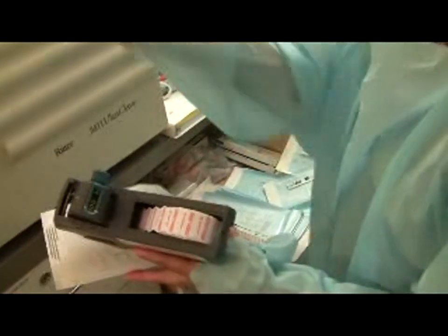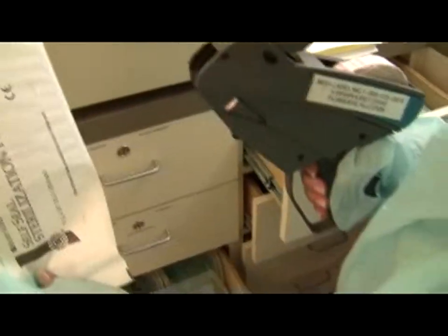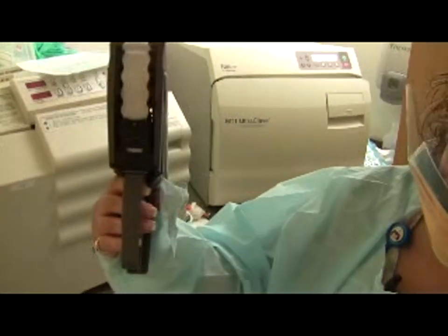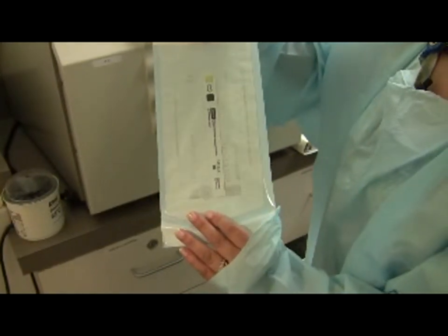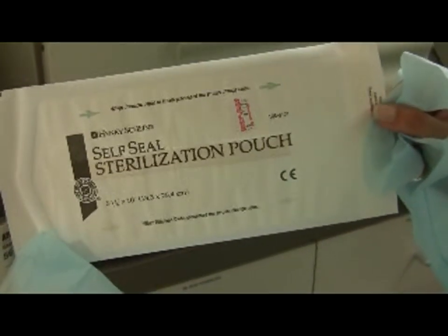Put the date sticker on each pouch — squeeze the sticker gun handle to release a sticker, then roll it across to apply. Each pouch must also have an indicator strip. The unused strip is black with a yellow box; when proper sterilization has occurred, the yellow box turns black. Each pouch also has four blue arrows on the back that turn purple-black when proper sterilization has occurred. Both indicators should show sterilization before use.